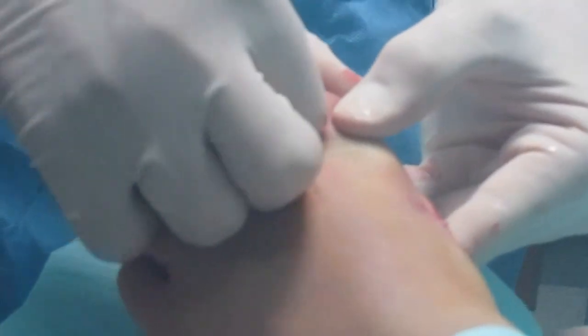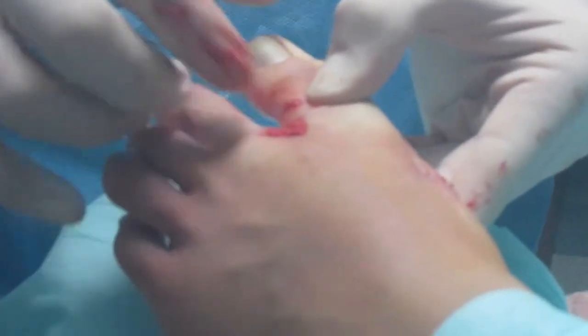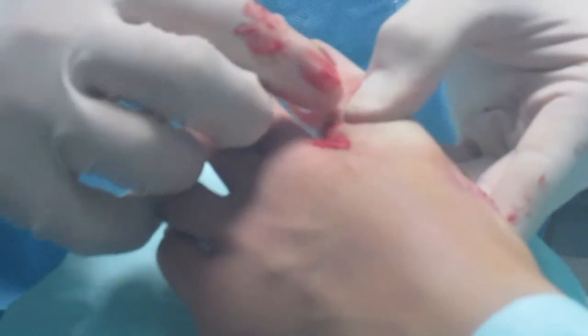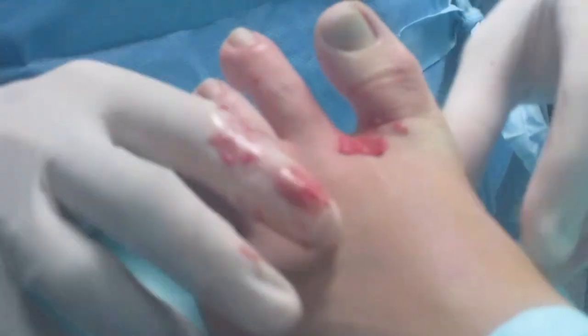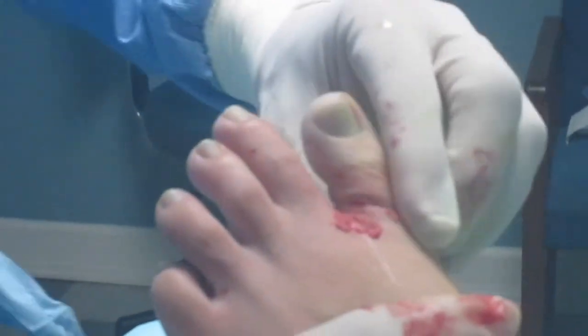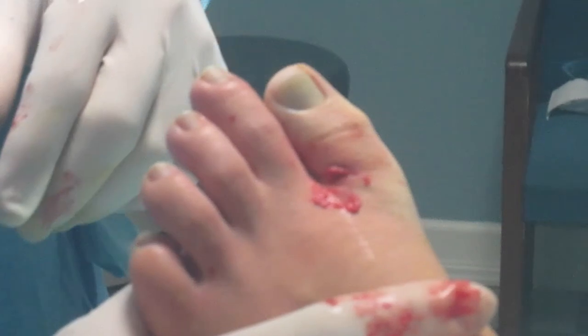You can green stick fracture this. It's a little snapping, you can actually feel it. So the green stick this down laterally and also plantarly to take the hump out of our toe here. See, now the hump's out of the toe and the toe's over lateral. So now we got a much better improved joint function and position of this bone. So now the ligaments are going to pull in a more appropriate manner.